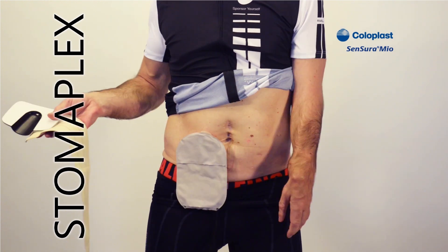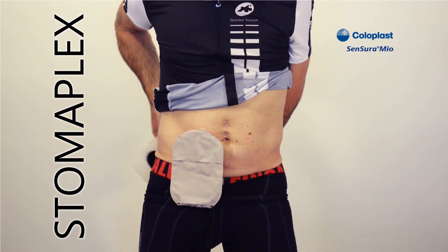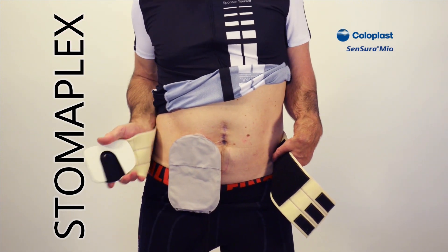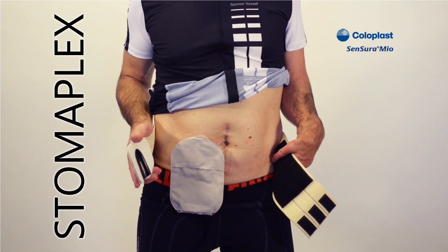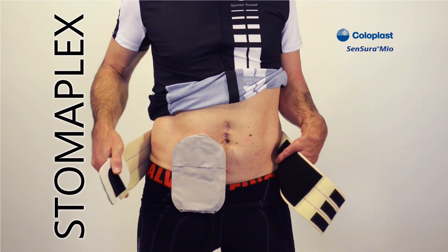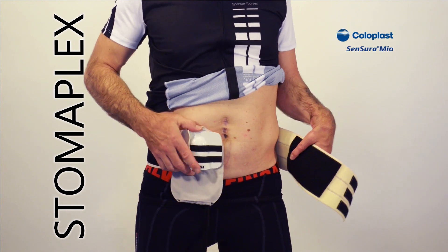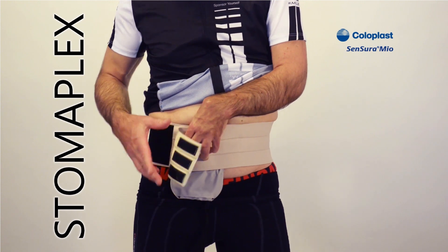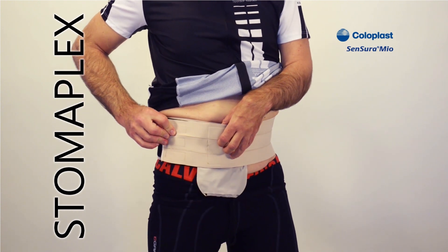So now you have one piece of assembly. Bring the belt around to the back, line up the guard over the ostomy, and place the white pad onto the plastic ring of the ostomy pouch and appliance, just like this. Bring the straps around — it's going to be a little bit tighter — and then attach them on each side. And now you're all set.